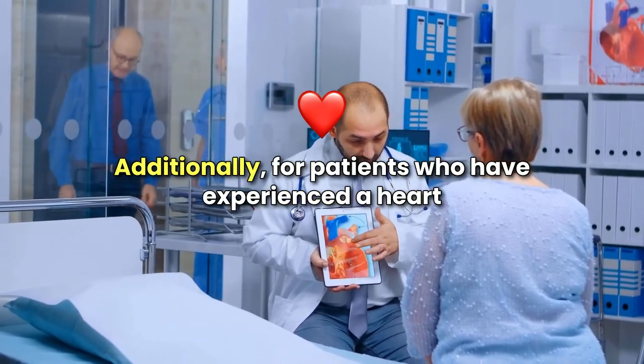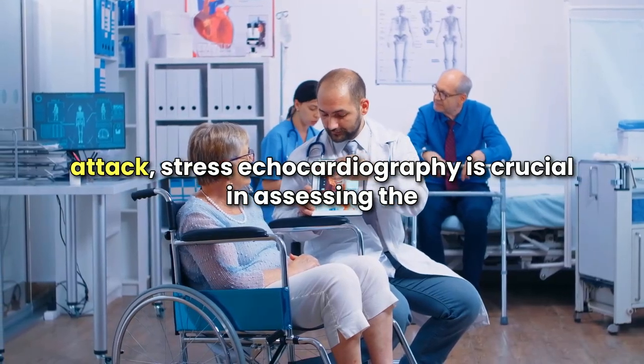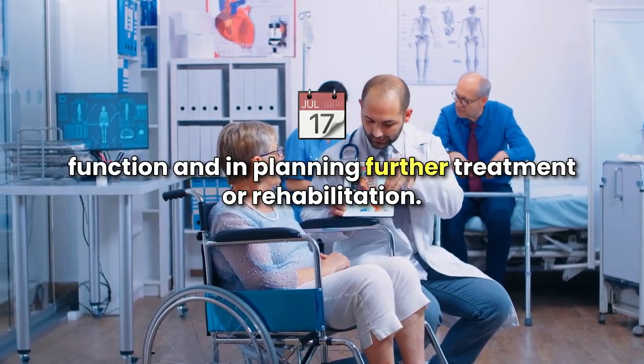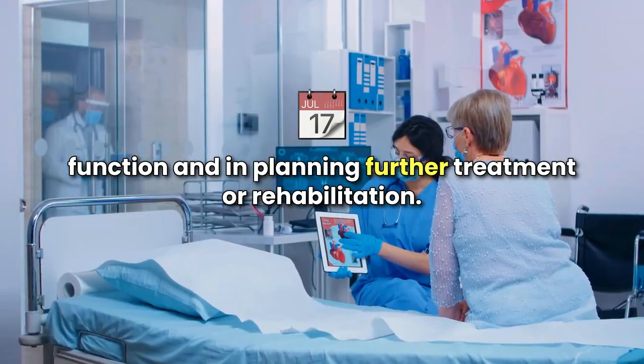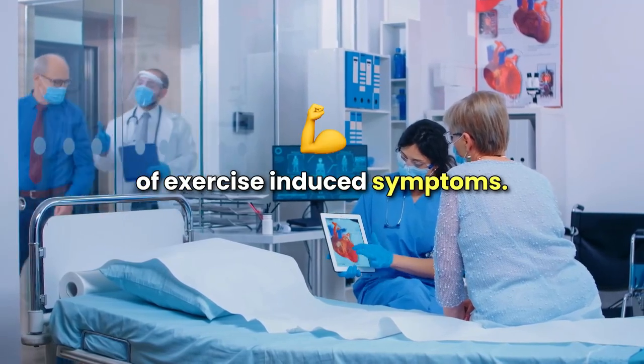Additionally, for patients who have experienced a heart attack, stress echocardiography is crucial in assessing the impact of the heart attack on the heart's function and in planning further treatment or rehabilitation. Next, let's discuss the assessment of exercise-induced symptoms.